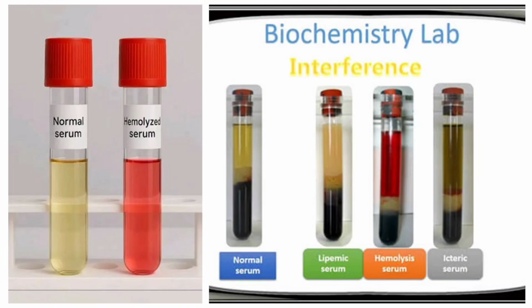That is why in validating results, one of the things you have to consider is pre-analytical. You must check that the sample you are analyzing is within acceptable condition for you to be able to finally authorize or release that result. So I want to put that out there first. Let me say this again: a result being within linearity does not all the time make that result correct.